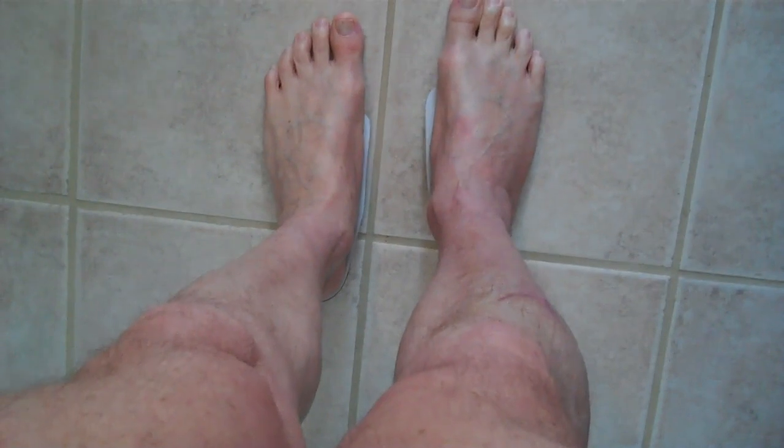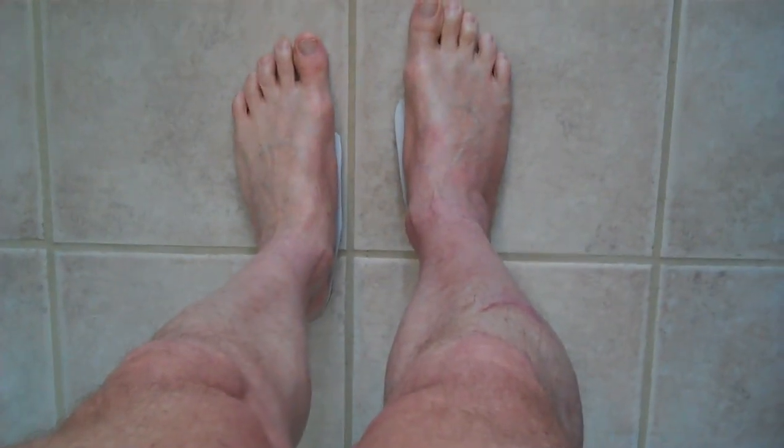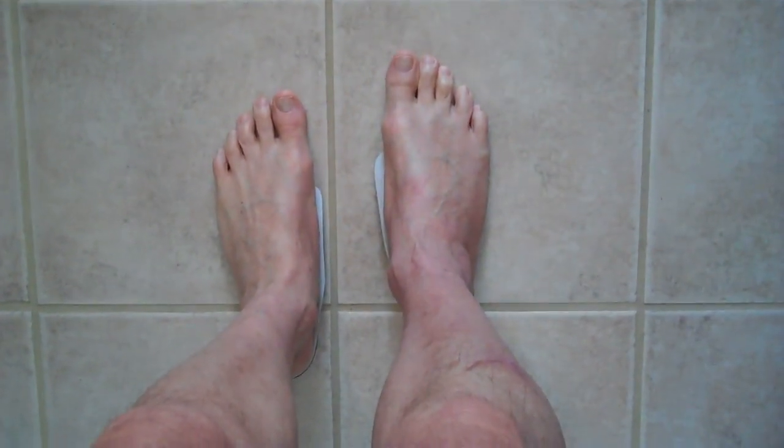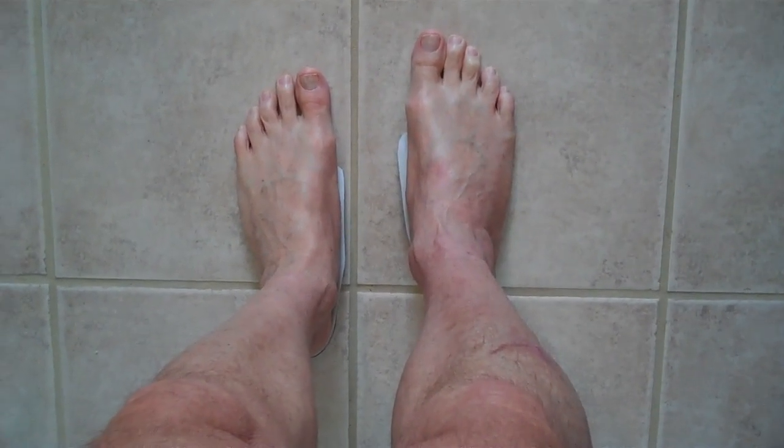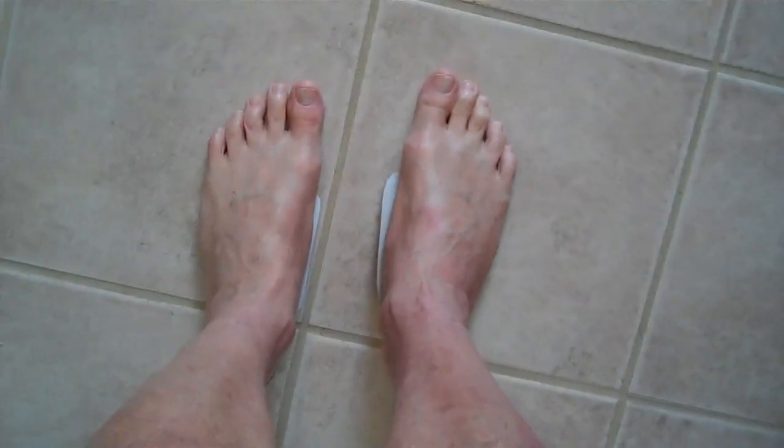This is what it looks like with the orthotics on. It looks like a pretty straight ankle, and it also lifts up the arch. Now, without the arch, see how the ankle overpronates?